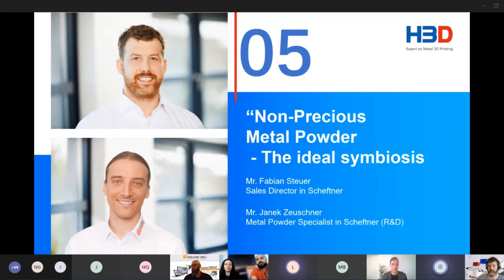Okay, thank you. And one last question is, how many times can your powder be recycled for printing? Maybe you can answer them. Thank you. This is a good question. Officially, I would say please only use it once.